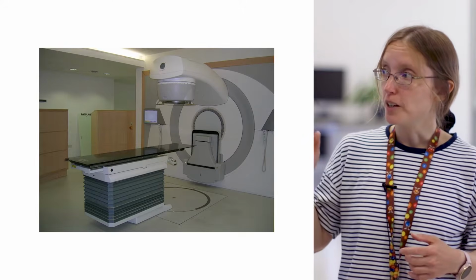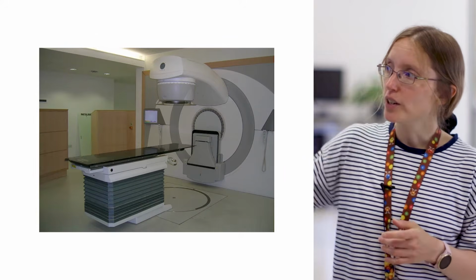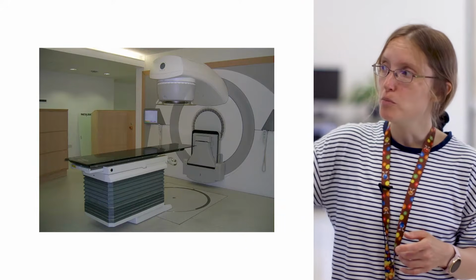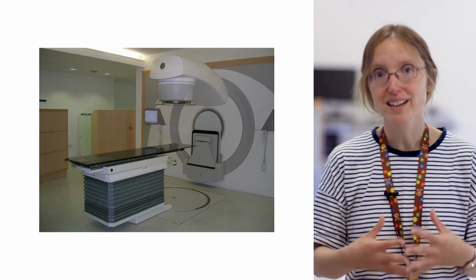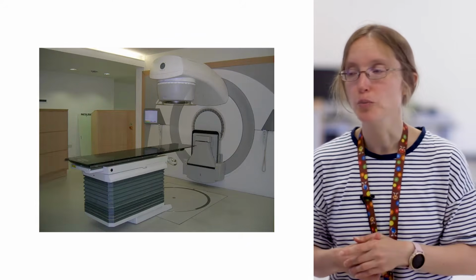The radiotherapy comes out of the round head of the linear accelerator, and that grey circle is essentially a gantry. So that head can move round in a circle, and radiotherapy can be delivered from 360 degrees. We typically use multiple beams to angle around the patient so that they all centre in on the tumour, but again minimising the dose to the individual normal tissues.